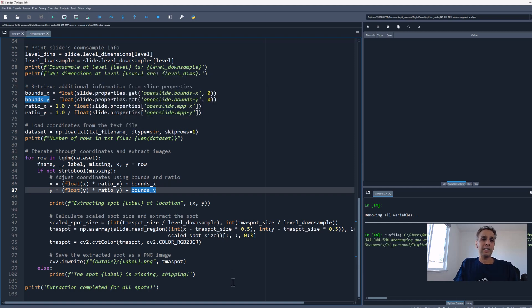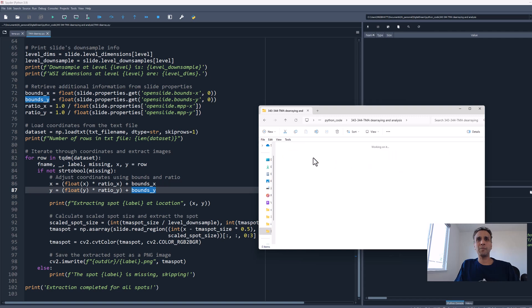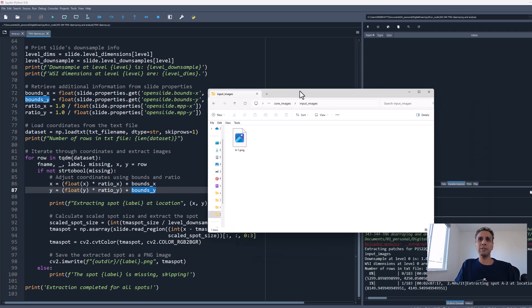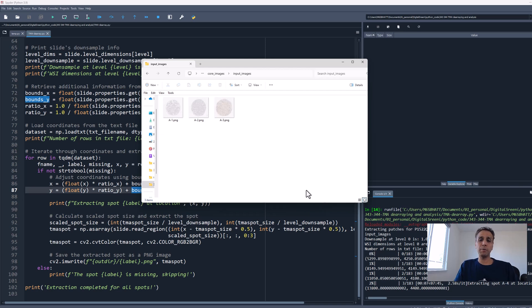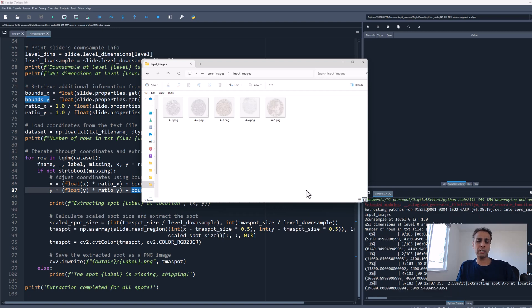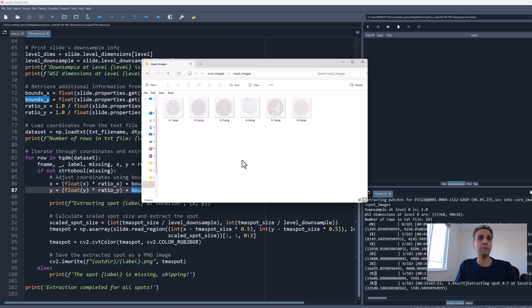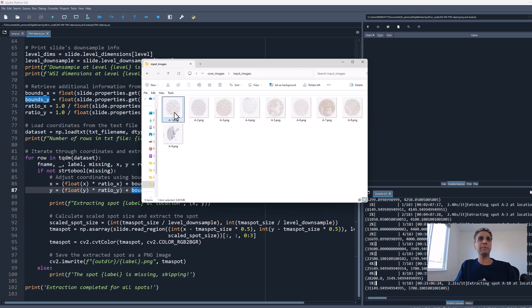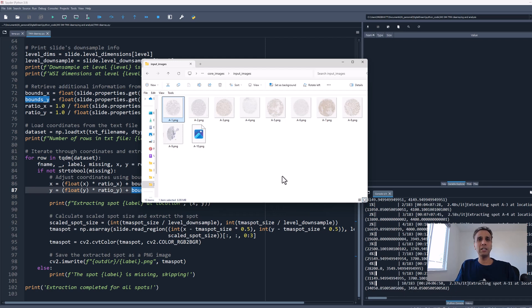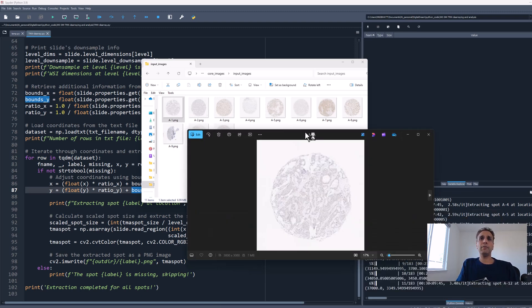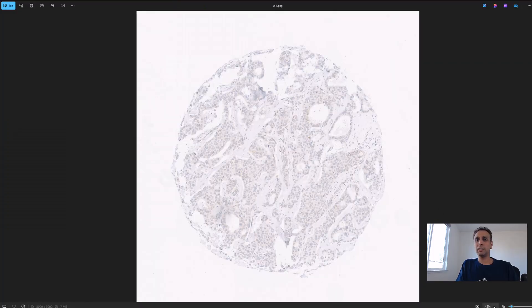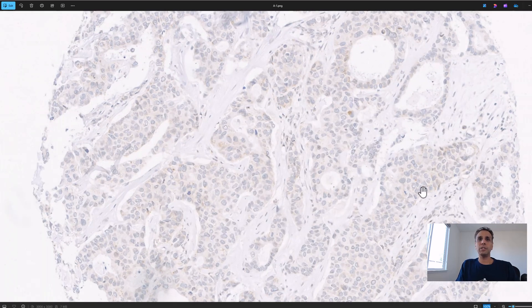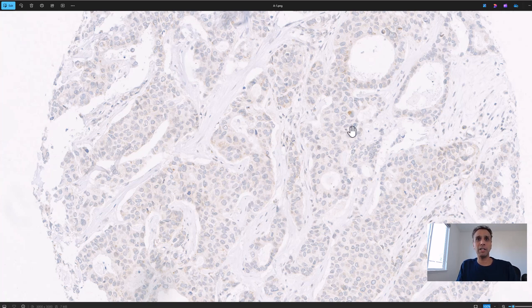Let's open core images. I have print statements so you can see A1 is extracted. It's going through each of these. This is slow only because I'm doing a million things on this system and I have Google Chrome open which sucks all the resources. A1, A2, A3, A4, and so on. Let me open A1. We're saving them at their native resolution.